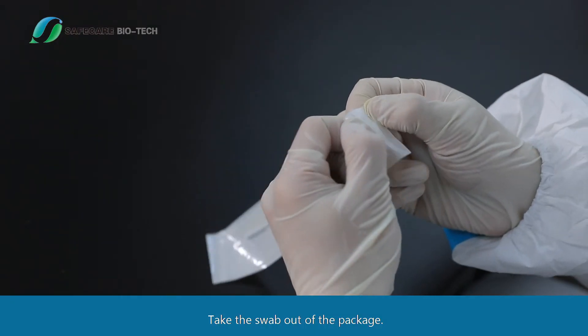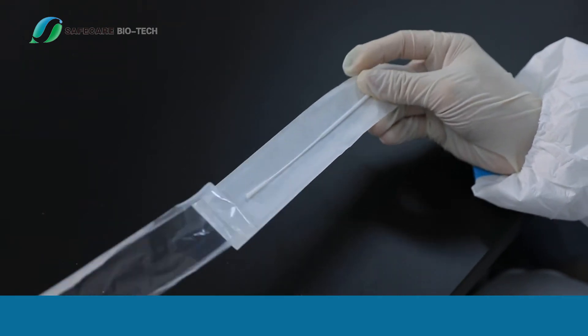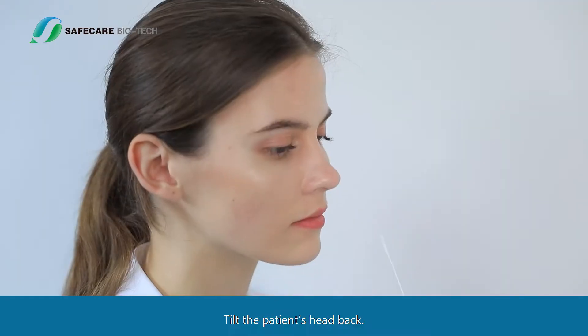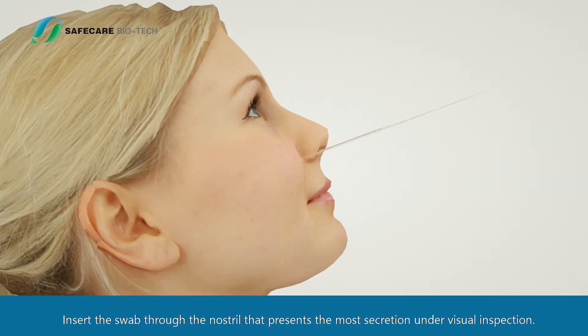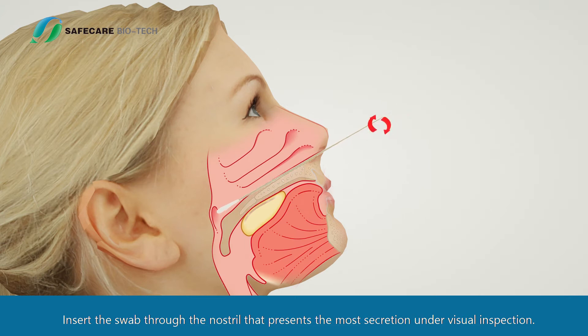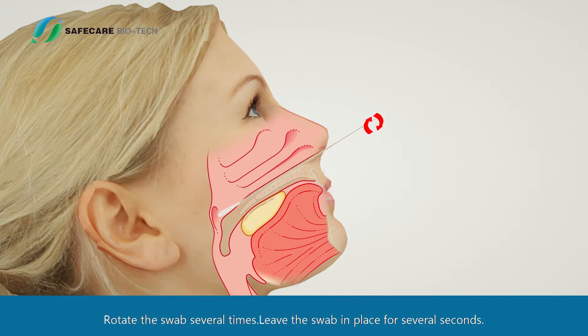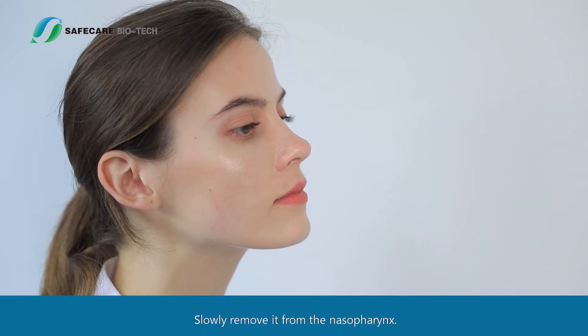Sample Collection: Take the swab out of the package. Nasopharyngeal Swab Sampling: Tilt the patient's head back. Insert the swab through the nostril that presents the most secretion under visual inspection. Keep the swab near the septum floor of the nose while gently pushing the swab into the posterior nasopharynx. Rotate the swab several times, then leave the swab in place for several seconds. Slowly remove it from the nasopharynx.